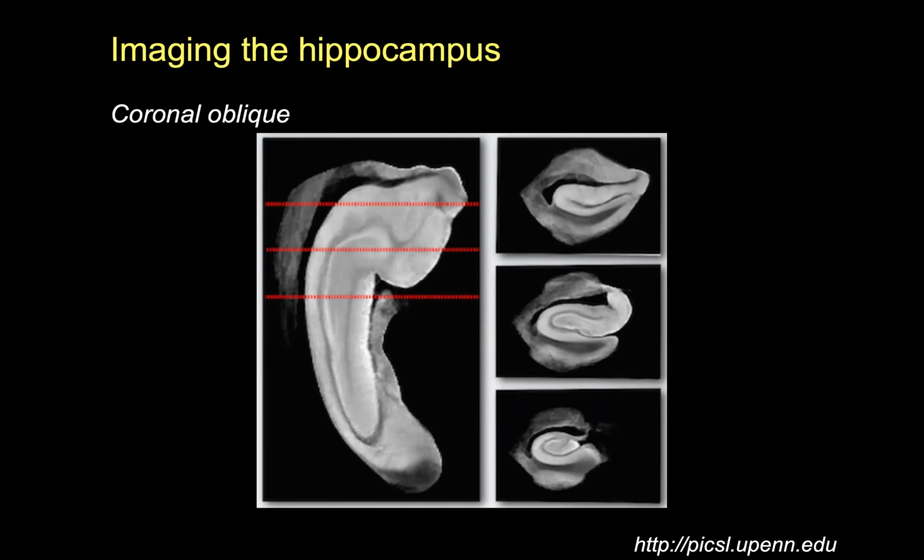It's an important point. So if we do ex vivo imaging, as in this image, you can see here beautiful cellular lamination within the hippocampus that really shows you images that are almost as nice as what you'd see histologically. And in cases like this, this is a normal hippocampus, but if it was an example of someone who had hippocampal sclerosis, you may very well be able to see ultrastructural changes by MRI that would not be evident at lower field strengths or in an in vivo sample.